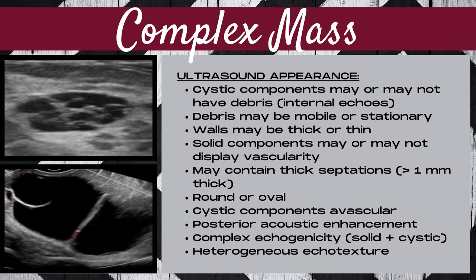The ultrasound appearance of a complex mass is highly variable and dependent on whether the mass is suspicious or more benign in nature. It may or may not have debris or internal echoes within the cystic components, and this debris can be mobile or stationary. The walls can be thin or thick, the solid components may or may not display vascularity, and the mass may or may not have thick septations — defined as septations greater than one millimeter thick.